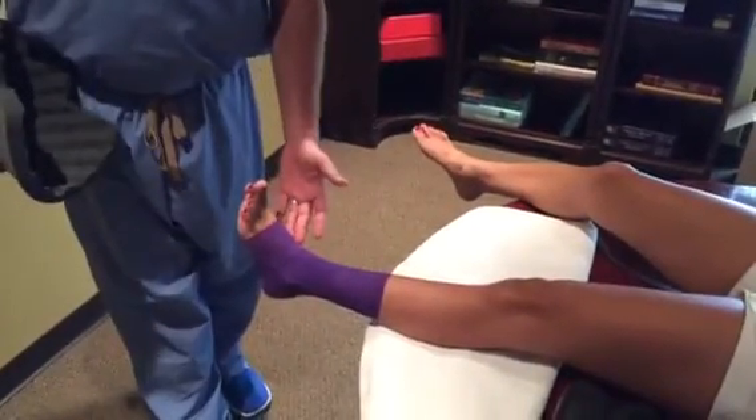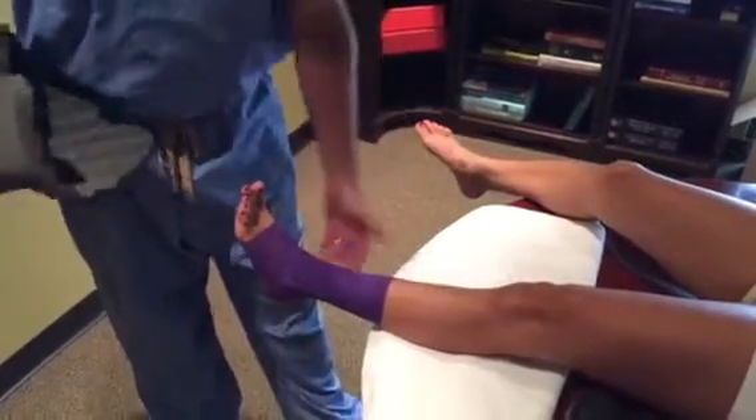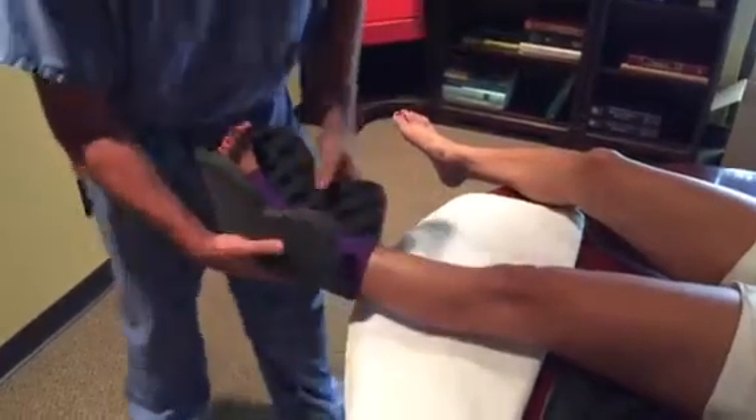General rule of thumb: they're going to wrap the patient's heel on the operative side with co-band. After that, the foot will come in and obviously make sure that the heel is down.